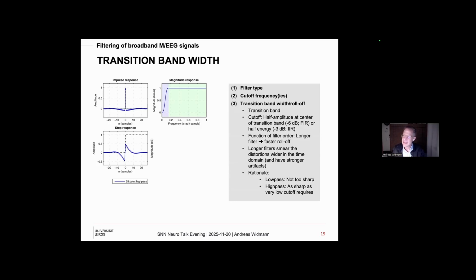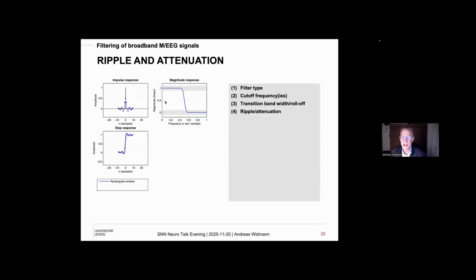And if you separate them and just use two filters separately in serial order, and the order doesn't matter, it's perfectly irrelevant, it's all linear, you could have the low pass artifacts very restricted in time. For the high pass, you are lost. But that's the reason for not using bandpass filters. Use high pass and low pass filters separately and tune them separately to your application.